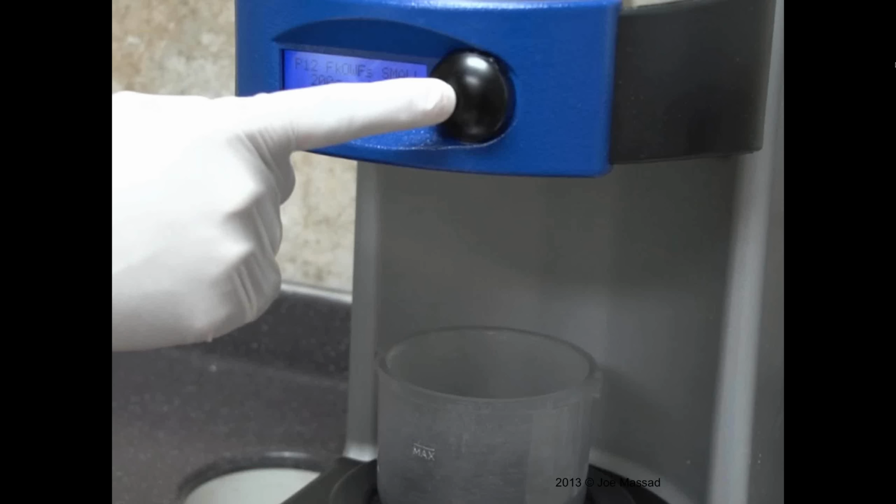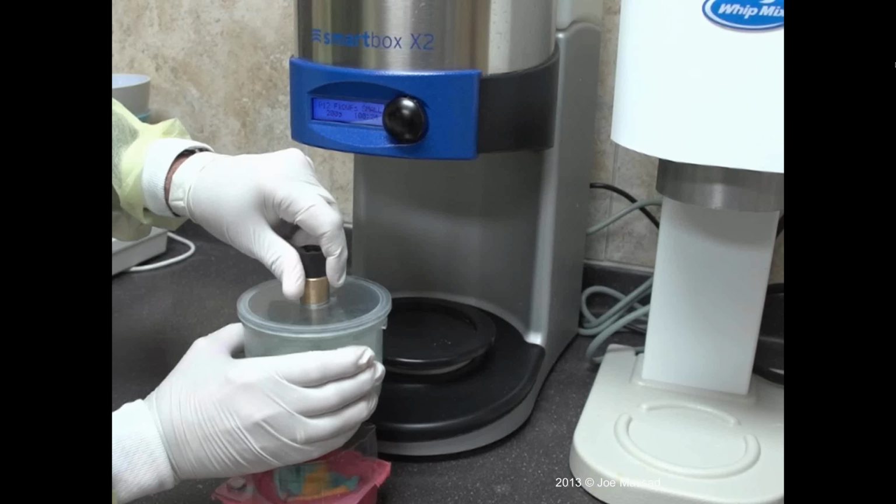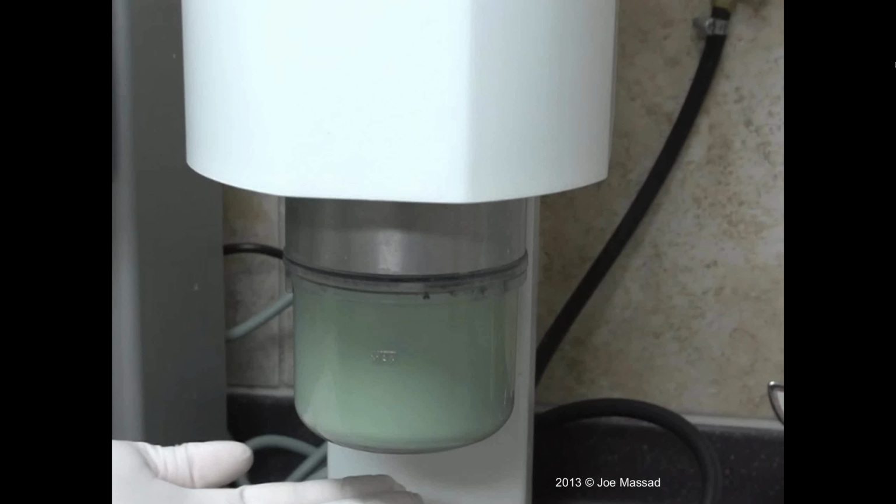In this particular case, I'm not even mixing it. I'm just going to put it into this little spinner here, and I already have it programmed. Now, I actually utilize a full 30 seconds, and I go to about 400, go as high as 500, and their recommendation, I believe, was between 3 and 5. And I just, with trial and error, I like a little faster spin. I don't want any clumps, any lumps. I want to be able to pour it exactly, and I leave it on a 30-second.